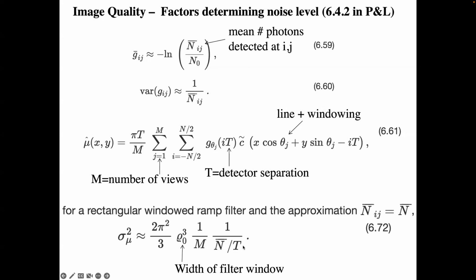Interestingly, if you change the width of the detectors and add twice as many, you get the same variance. So think of that. If I had 1,000 detectors and I say, I want a higher resolution picture, I'm going to do 2,000 detectors, right? So we cut those in half, right? So, I get a bigger N, but the T also changed and they cancel each other out.